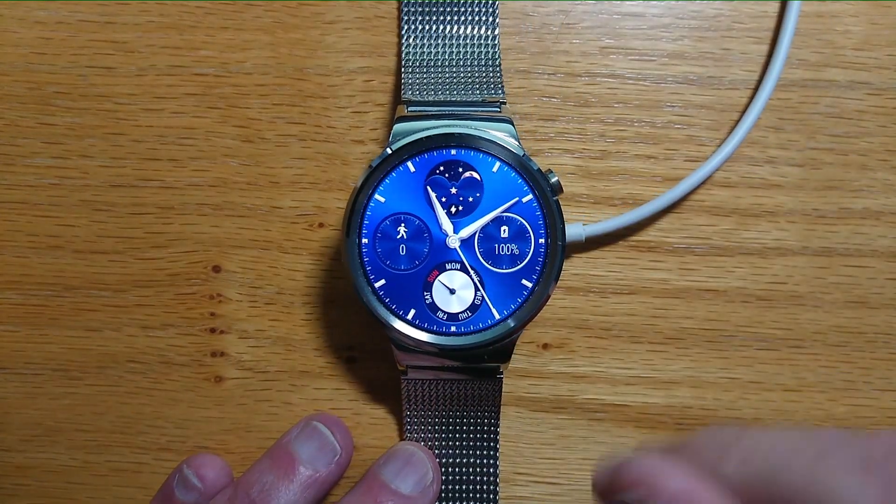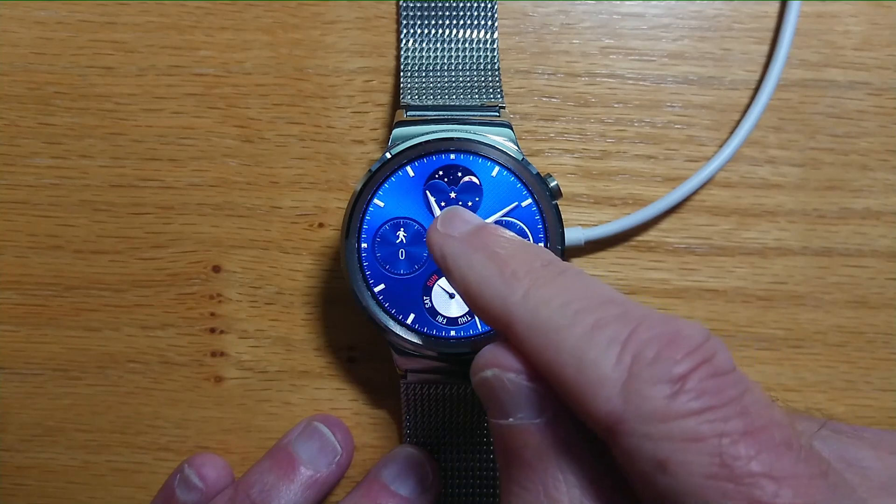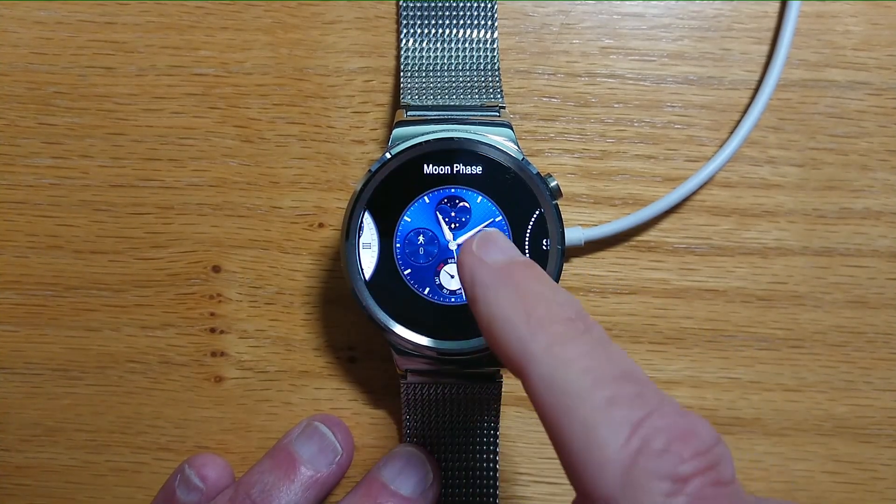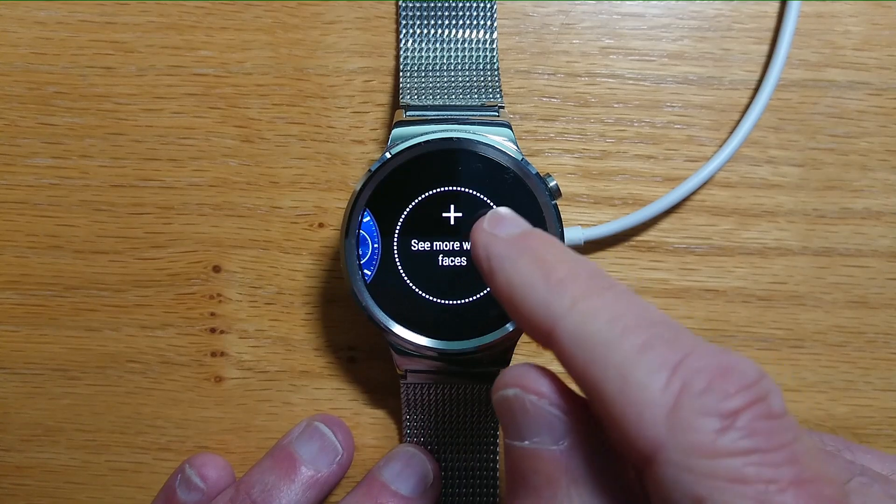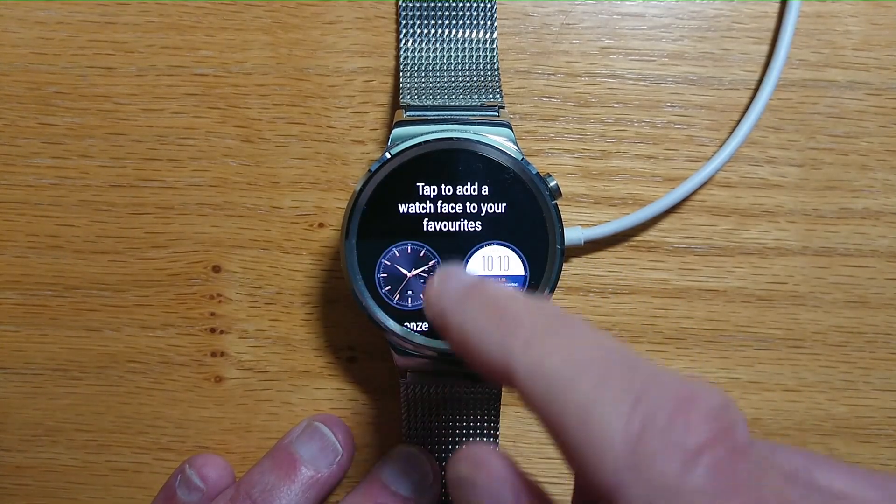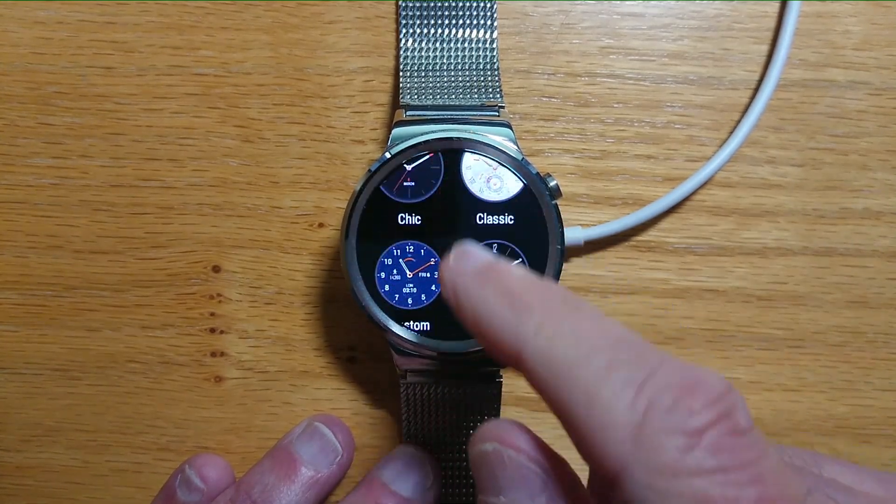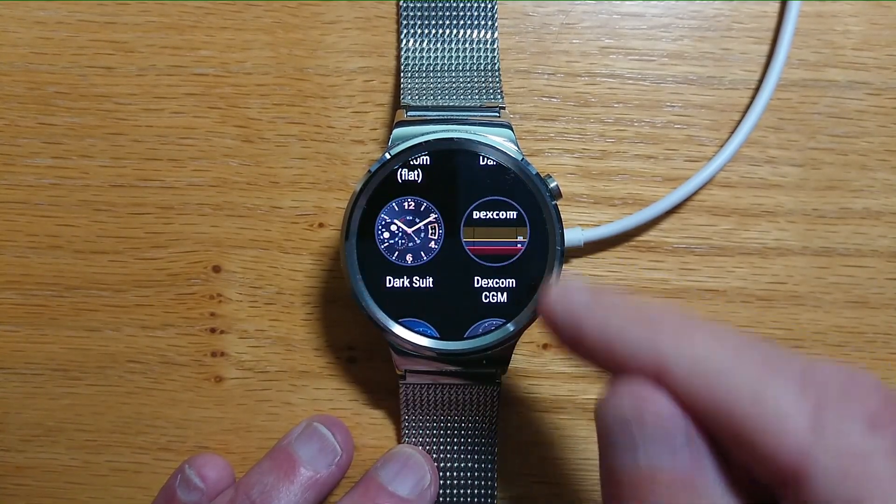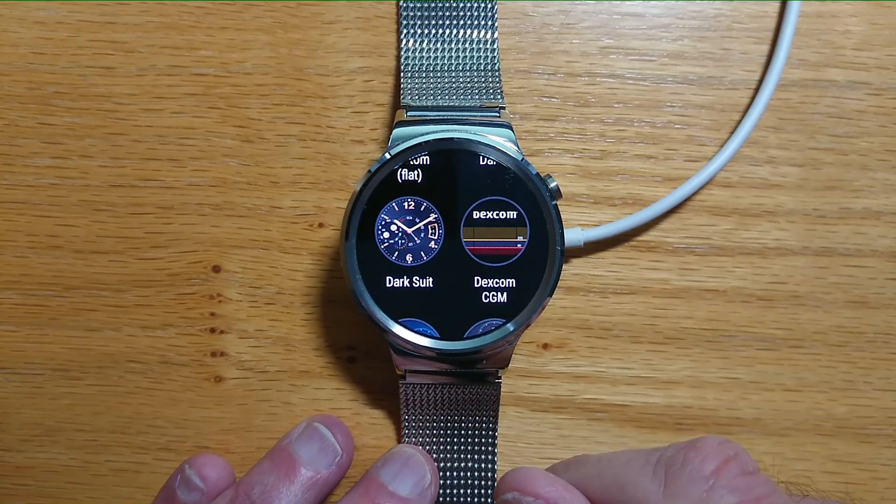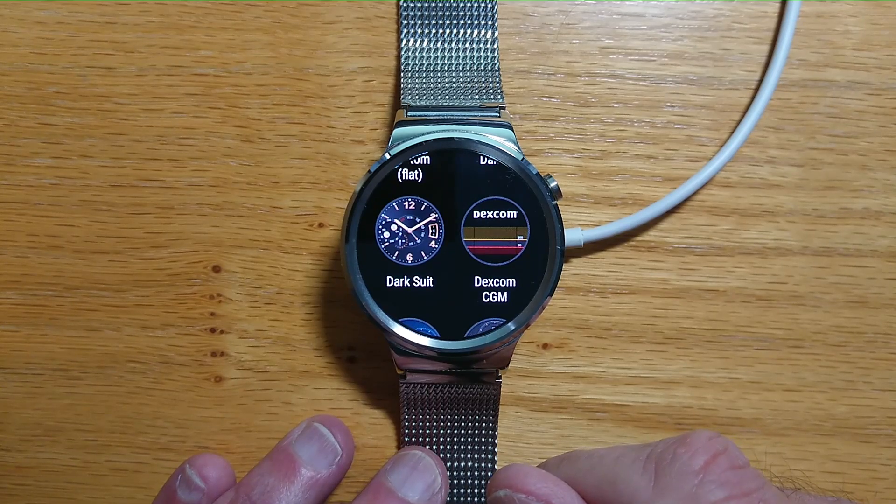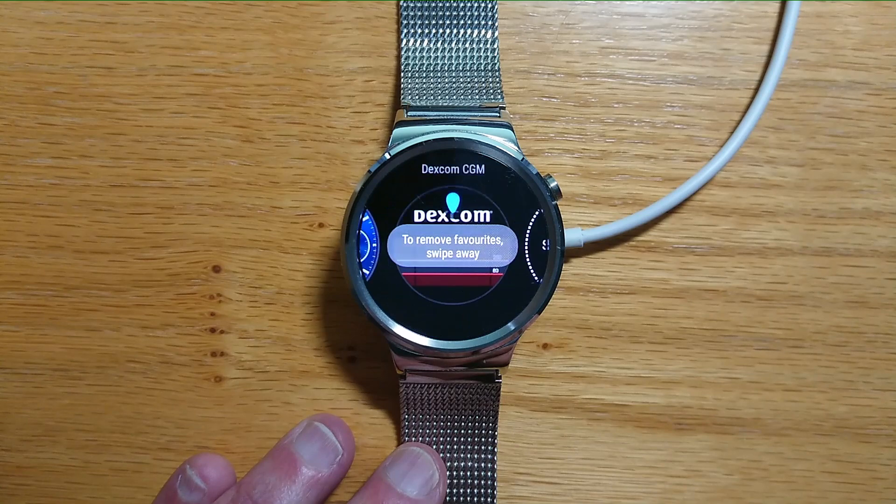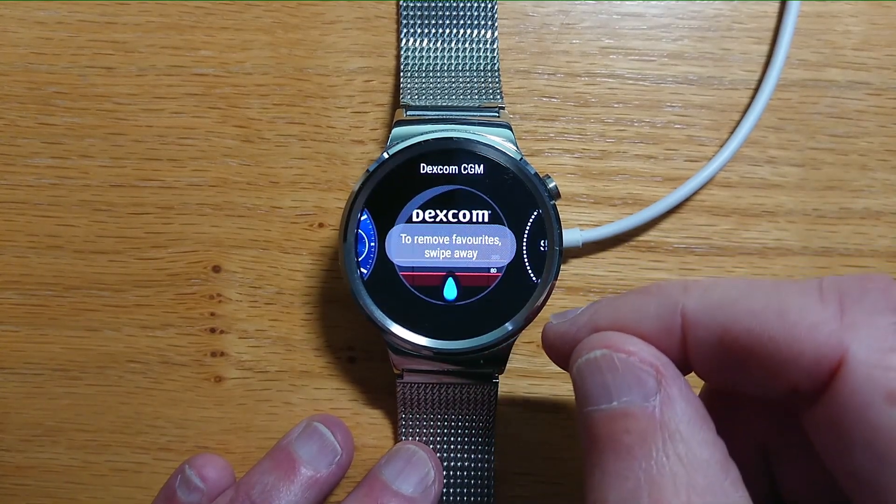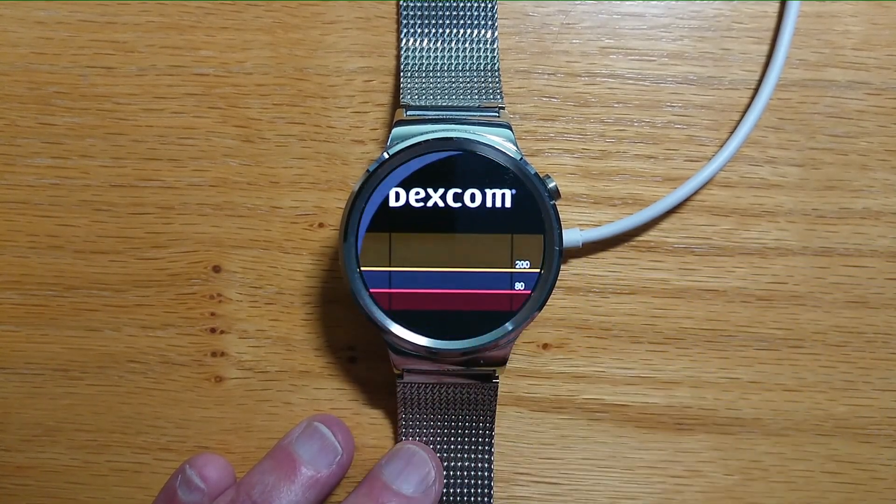Now if I go to my current watch face and long tap, it gives me options for more watch faces. If I scroll down, I can see there that Dexcom CGM is one of the options, so it's easy to select that and use that as the watch face.